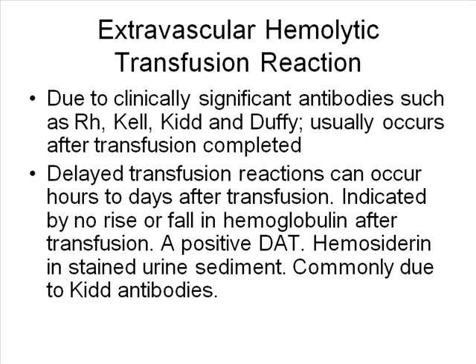Exactly, and you're not going to know that. There are many unusual antigens, which you can have a patient that might have one of those low incidence antibodies, and there's just no way to test for it unless for some reason that antibody is high enough that when you pick that unit, you're going to get an incompatibility. But with electronic cross matches and immediate spin, you're not going to see it.